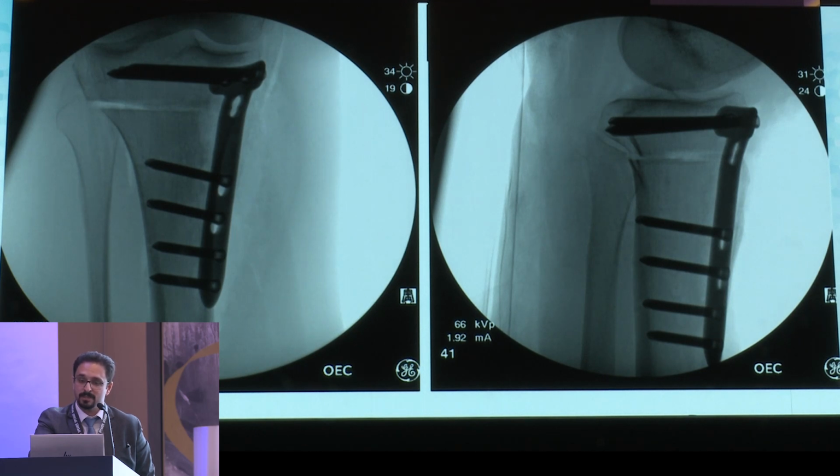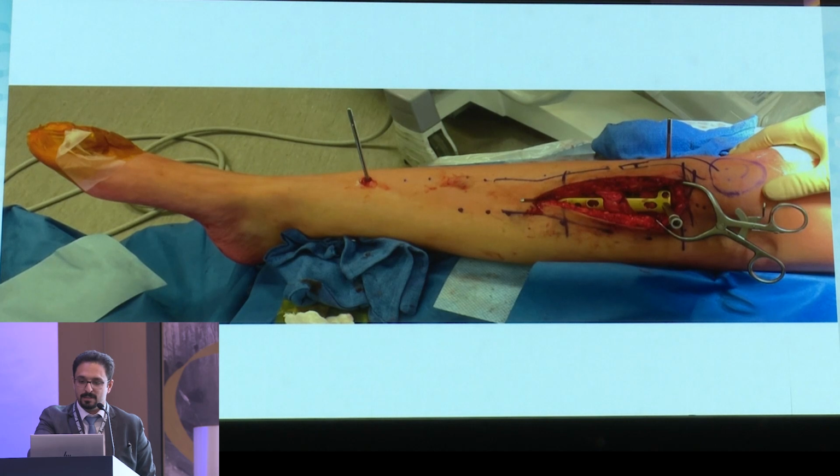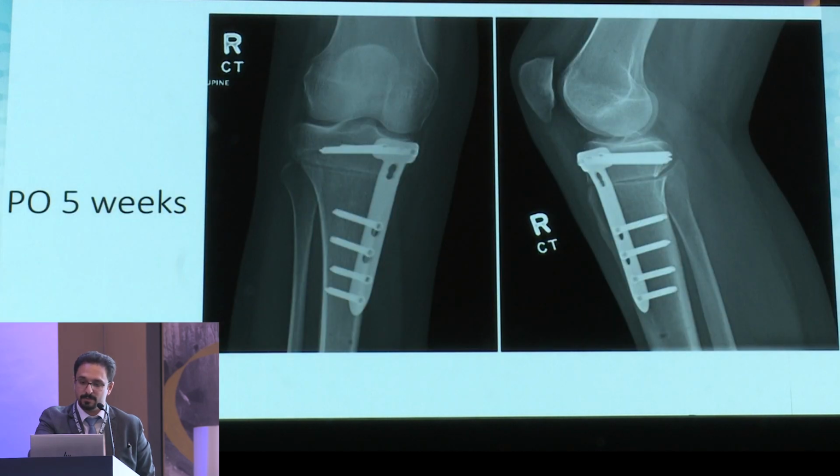We do the osteotomy not low, we do it at the level above the tubercle, and because this is an external torsion, the foot is externally rotated, so when we internally rotate, we will also at the same time medialize the tibial tubercle. And if you see, the approach is very biological for osteotomies. If you're trying to do deformity correction, here we're preserving even the pes tendons. They're above the plate. And the plate is over there, post-op.